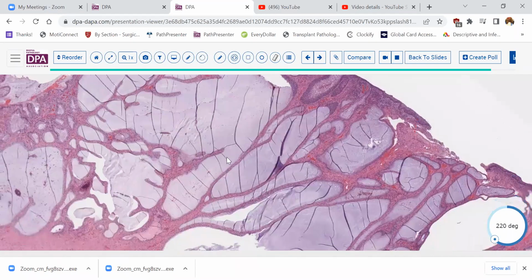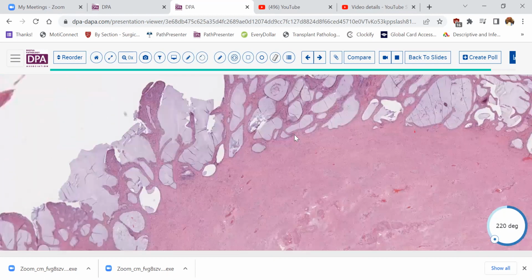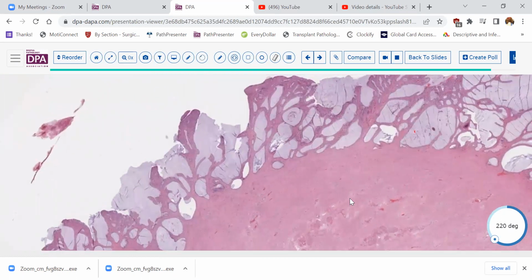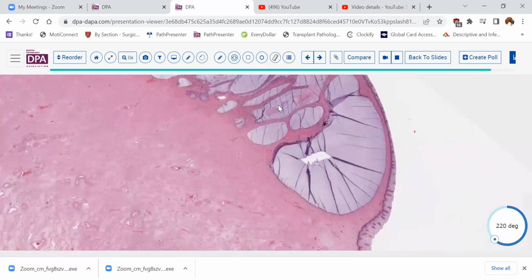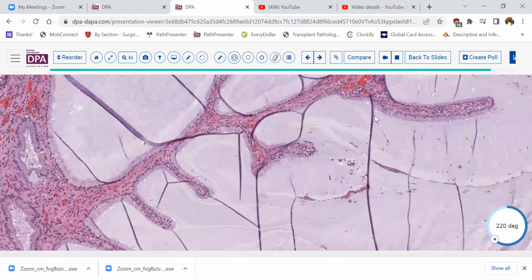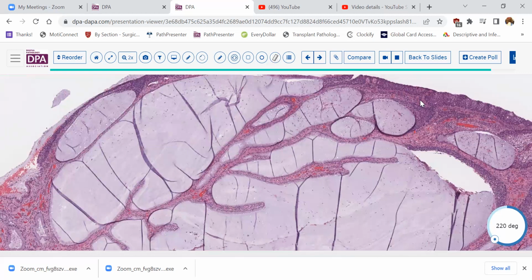So why does she have all of this mucin production here? This is much more mucin than normal. Well, as you may suspect, I didn't tell you all of the history here. But I thought it would be useful to bear this image in mind because we don't see this very often, but it can occasionally cause some consternation. So this is not a mucinous endocervical carcinoma. We see no significant atypia here. There's no stratification. There's no above the base mitotic activity. And of course, you can get associated adenocarcinomas with squamous intraepithelial lesions.